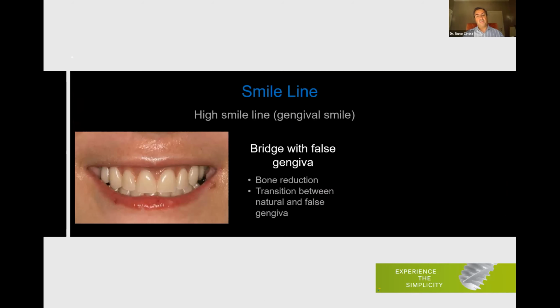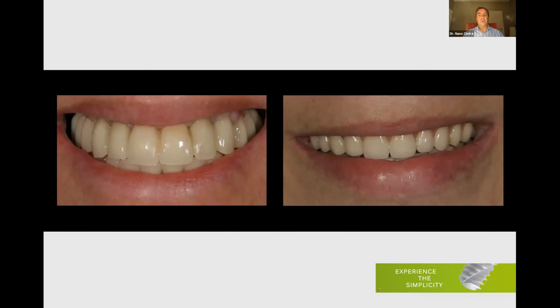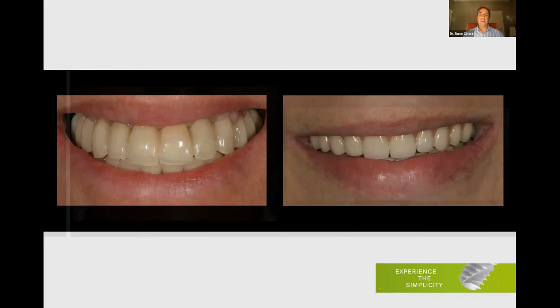Okay, so if you go for a bridge with false gingiva, of course we have to do bone reduction, because the implants have to be placed in a higher position to uncover the transition zone between the natural and the false gingiva. So we have these two choices: either don't touch the bone and keep the natural gingiva, or false gingiva, and for that, we need to reduce bone. Otherwise, the transition zone can be noticeable.